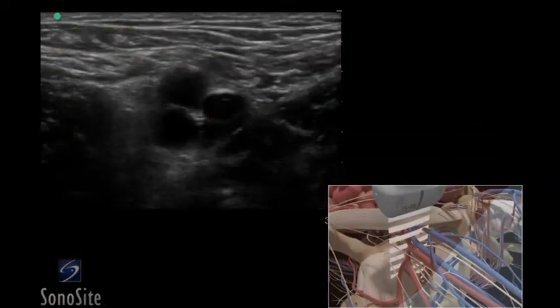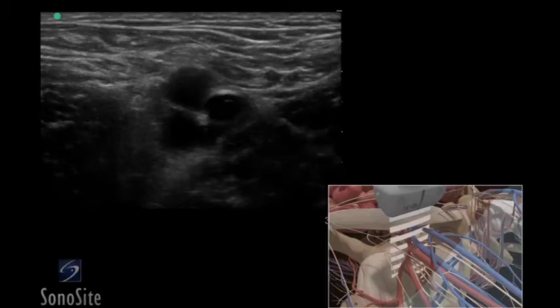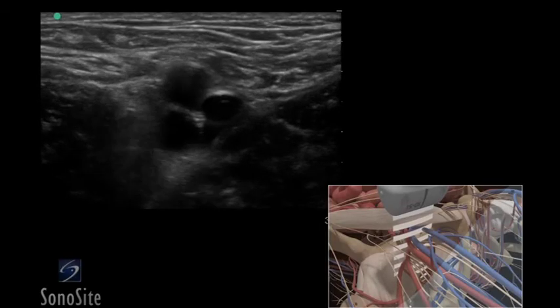The superficial femoral artery is seen as a dark, anechoic, pulsatile circular structure in the mid-portion of the ultrasound image. Deeper and slightly to the right of the image, the femoral vein will appear as a dark, anechoic, elliptical shape that is compressible with transducer pressure. Adjust the transducer so it is centered over the femoral vein, medial to the artery.